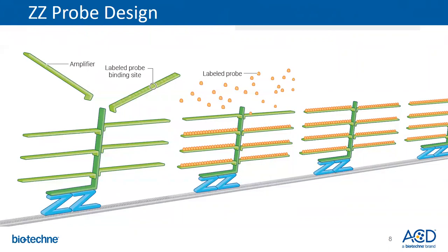As long as you get 6 pairs, 6 double Z pairs that bind somewhere along your transcript, you're going to see a dot. So if you have 20 available to you, you stack the deck in your favor of getting at least 6, right? After 6, it's just gravy. You get a slightly larger dot. You need 6 to see a dot in the first place.